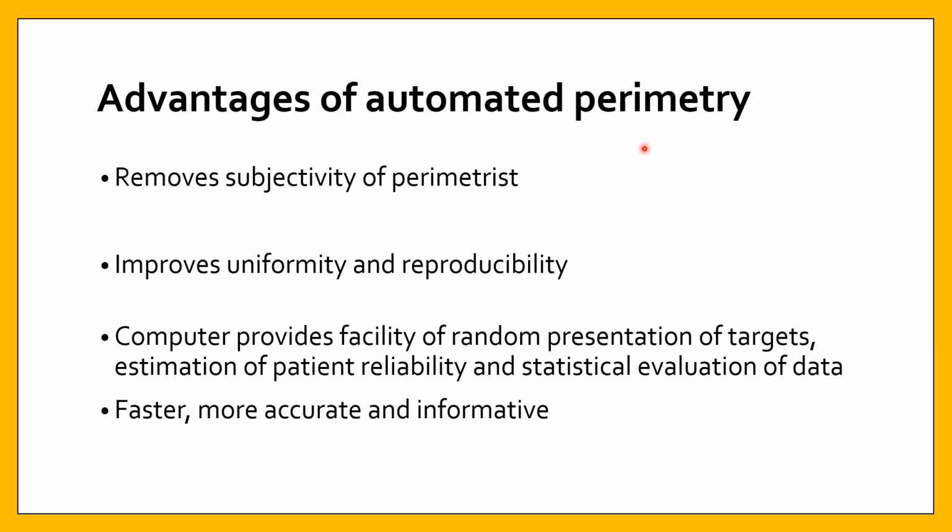Advantages of automated perimetry are that it removes the subjectivity of the perimetrist and improves uniformity and reproducibility. The computer provides the facility of random presentation of targets, estimation of patient reliability, and statistical evaluation of data; it is faster, more accurate, and informative.